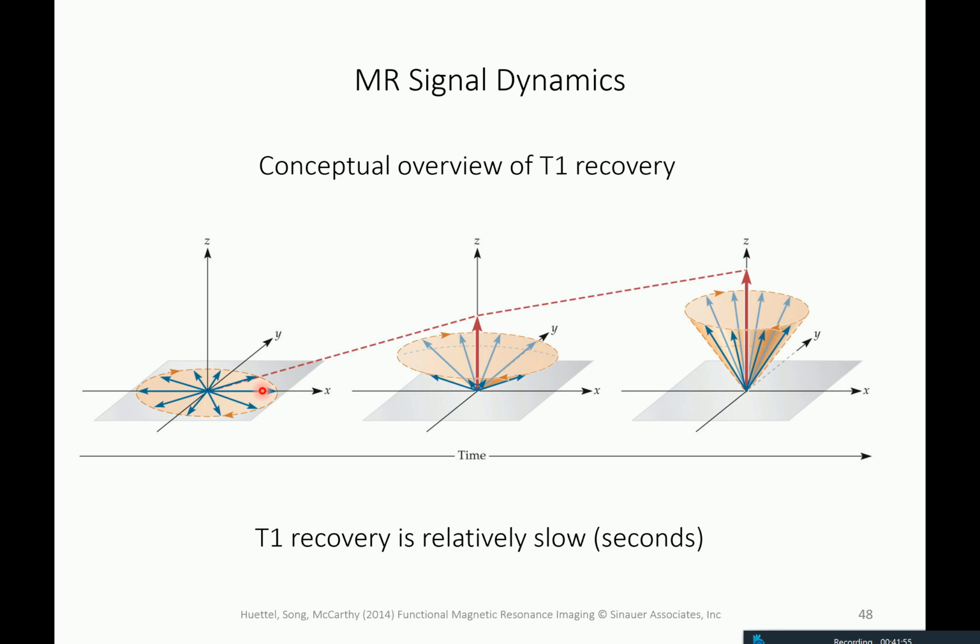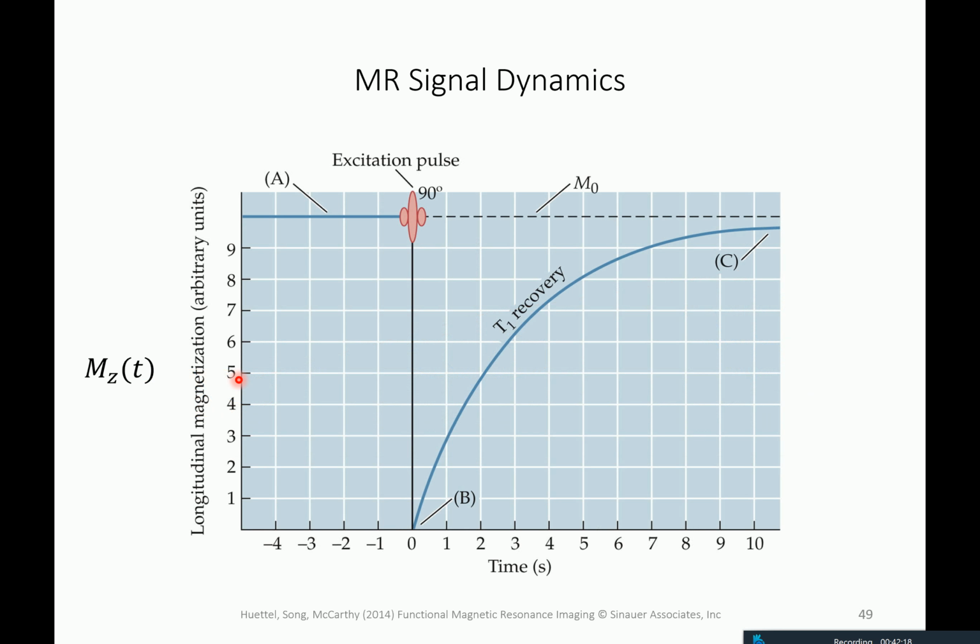So this can only be measured in terms of the signal that you get immediately after excitation. The machine doesn't see this directly, but you can measure it indirectly by tipping the signal at different time points after a previous excitation pulse. How that works, we will look at also in the next hour. Yeah?